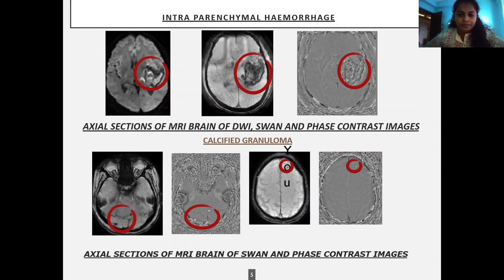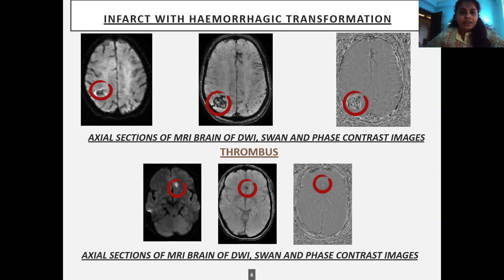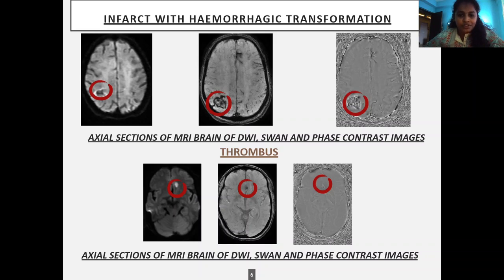Another example shows infarct with hemorrhagic transformation, where blooming in the right parietal region is seen and the corresponding phase contrast image shows signal dropout with no hyperintense signal, favoring hemorrhage. Next is an example of a patient with thrombus, where diffusion restriction with corresponding blooming is noted, and in the phase contrast image there is signal dropout favoring thrombus.